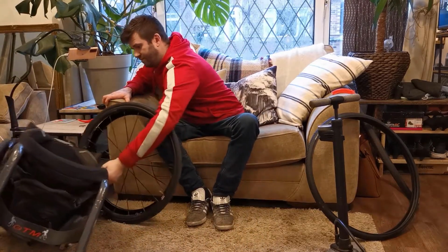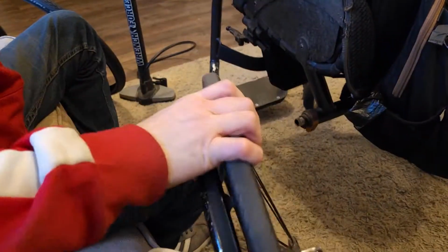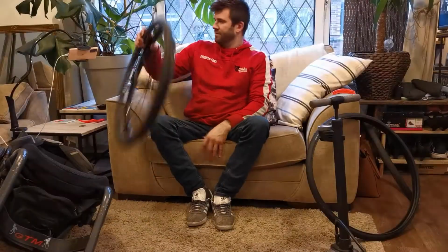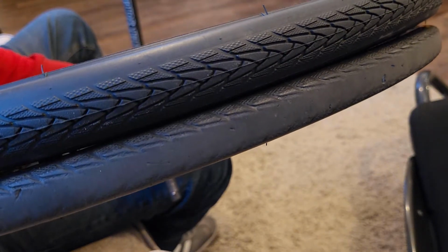And using the quick release wheel, so just pressing the button in the centre of the wheel, move my chair aside, but keeping it in reach because I've got to put that wheel back on. You can clearly see here how bald those tyres are. You compare it to the new one, there's obviously quite a difference in the tread.